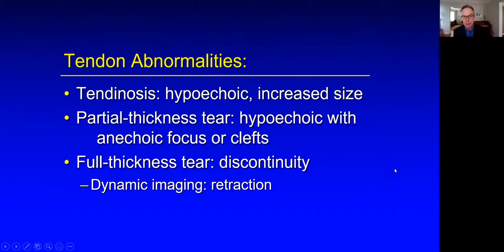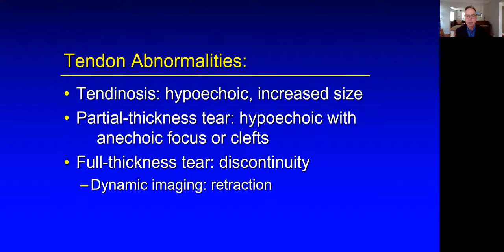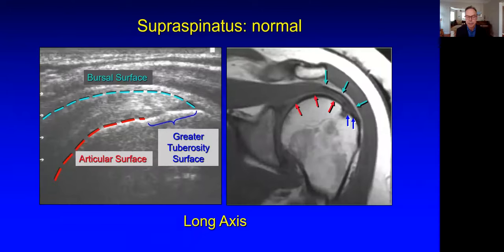When looking at a tendon abnormality anywhere in the body, I put them into one of these categories: tendinosis, partial tear, and full thickness tear. Tendinosis will appear hypoechoic with thickening of the tendon. Partial thickness tears will be incomplete disruption of the tendon, usually anechoic or hypoechoic. Full thickness tears will be complete discontinuity, often characterized with tendon retraction.